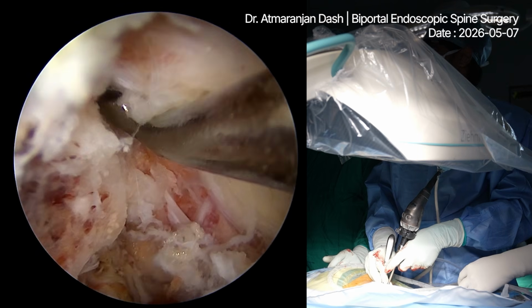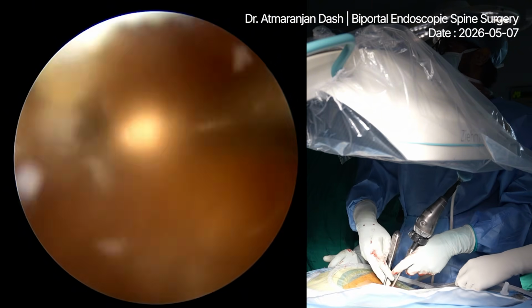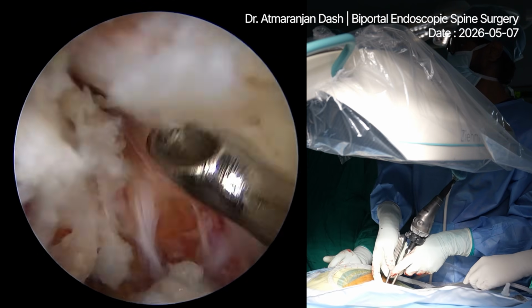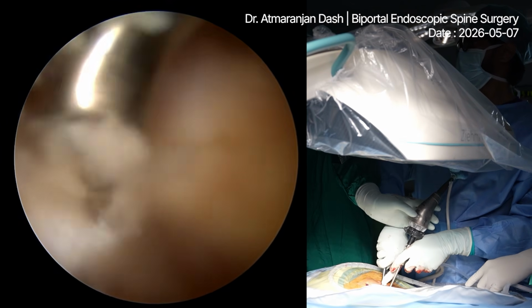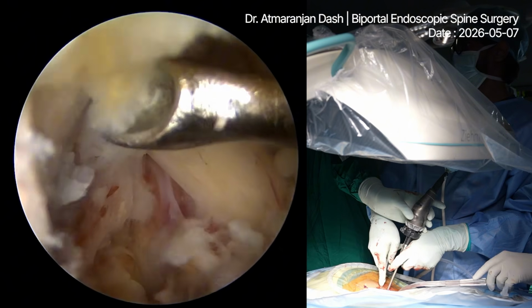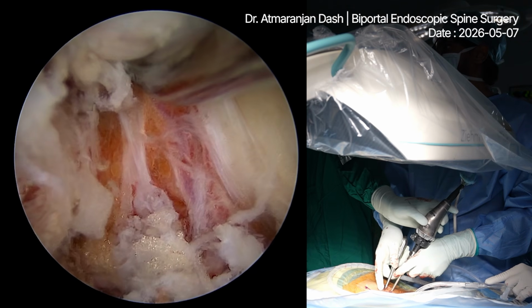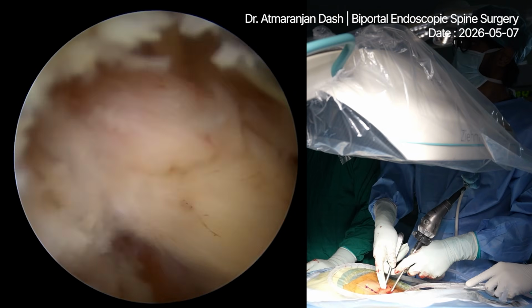Take a shot, you will understand. See, I am just in the pedicle, just a little away from the. Yes. So everybody can appreciate the pedicle here. Okay, take a shot, take a picture, take an image of the pedicle. Okay. Yes, sir. So a little more of the foraminal work, and my job will be over.